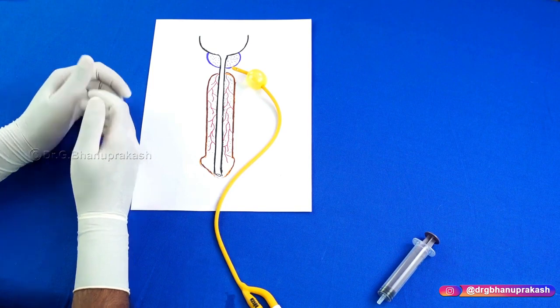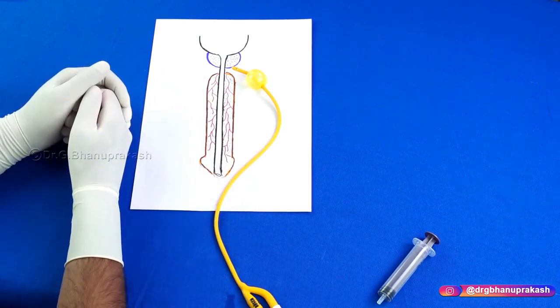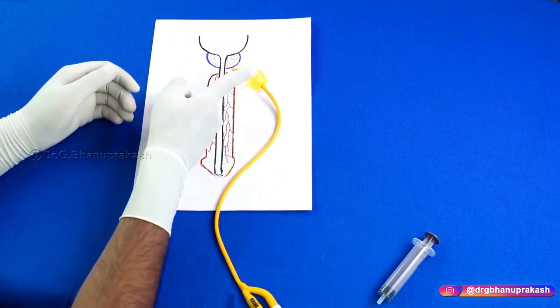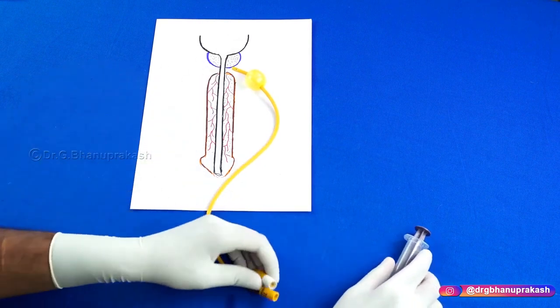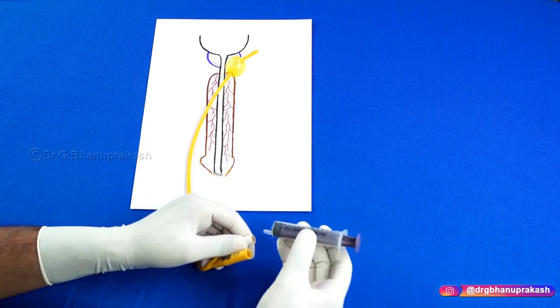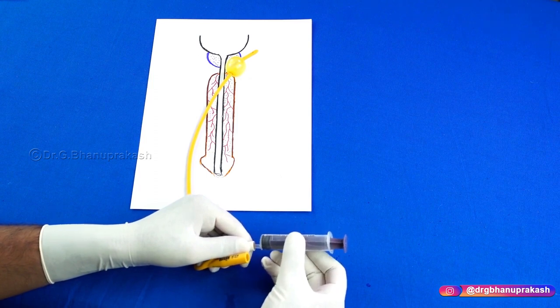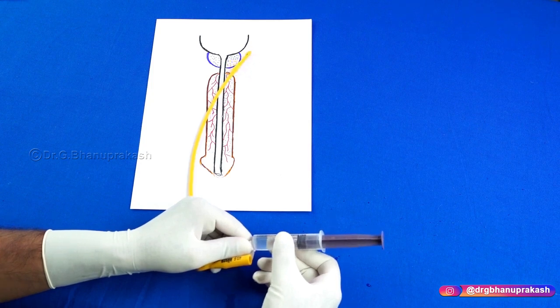Now, once the patient is getting discharged, obviously you remove the Foley's and discharge the patient. Now, how do you remove the Foley's? Within this bulb, the fluid is at high pressure. So what you do is you take the same syringe, the same 10 cc syringe which you have used before. Now I am inserting a syringe inside. When I insert a syringe inside, automatically the balloon will deflate. Look here. Because of high pressure, automatically the balloon deflates.